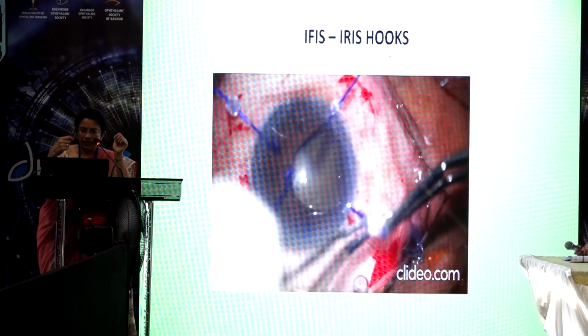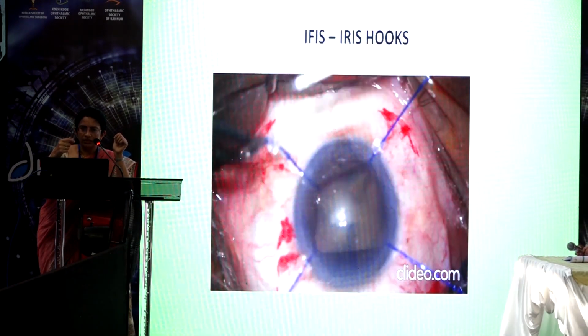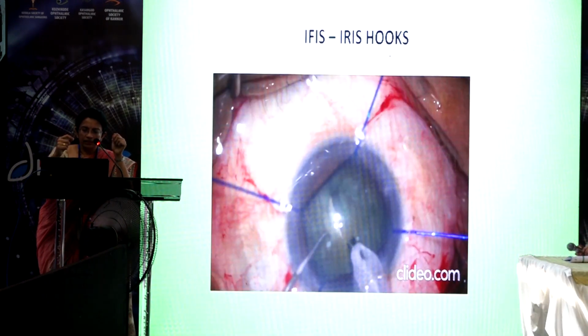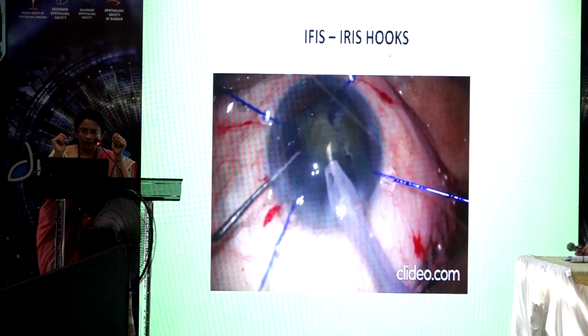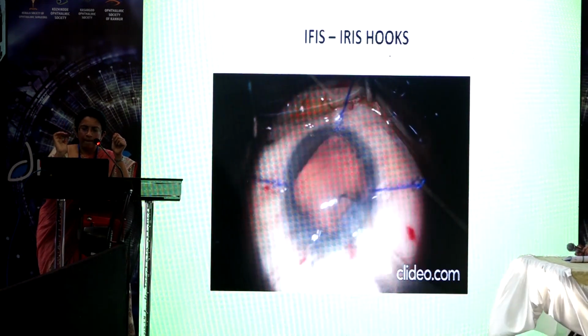And the only thing is you have to retract the sleeve adequately before hooking the iris, and then adjust the tension so that you get enough dilatation and don't tighten it too much. And then the rest of the things were done in the normal way. Phacoemulsification is carried out, again using low parameters.